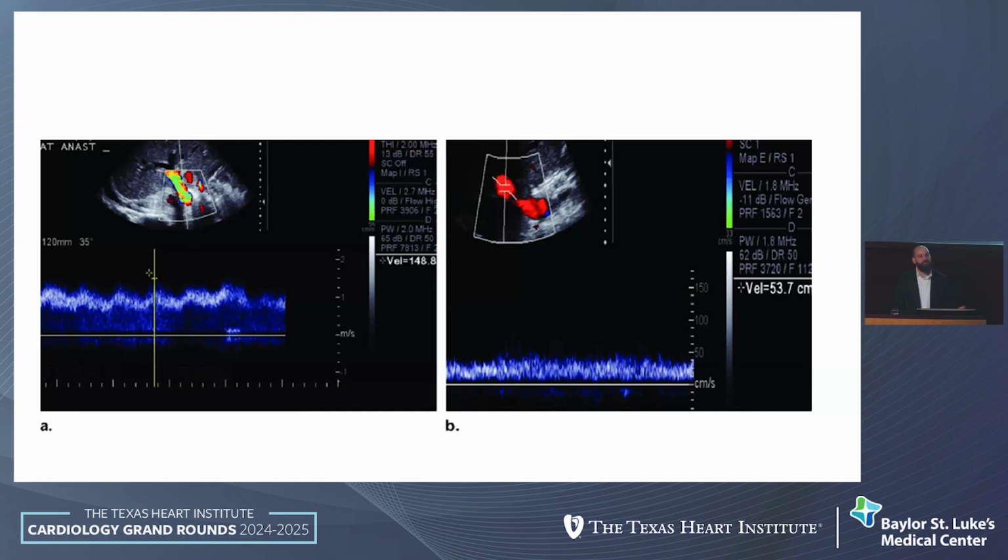And so the first thing we did was we diuresed the patient. And as we diuresed the patient, we opted for normalization of this portal vein flow, and we flattened that flow. This is whilst the patient is still on pressors. And as we diuresed the patient, you can clearly see that you could get the patient off the pressors.